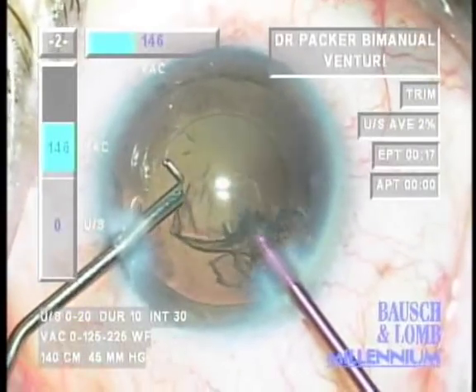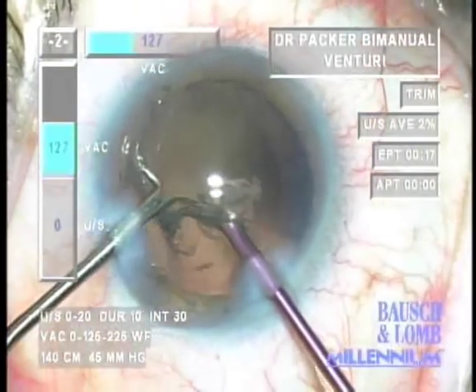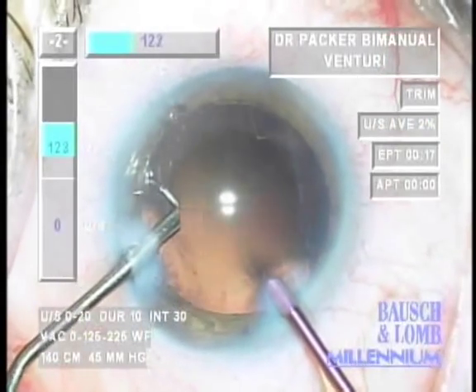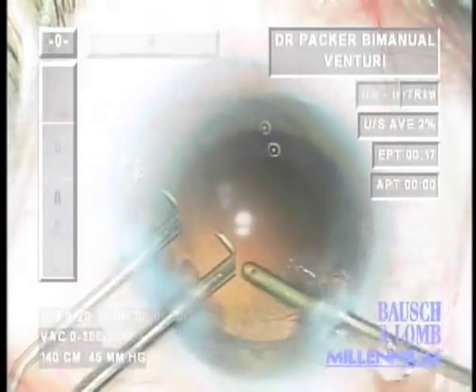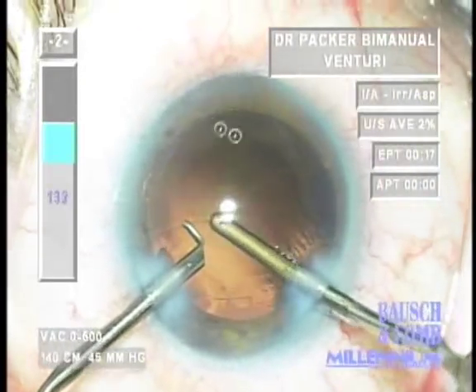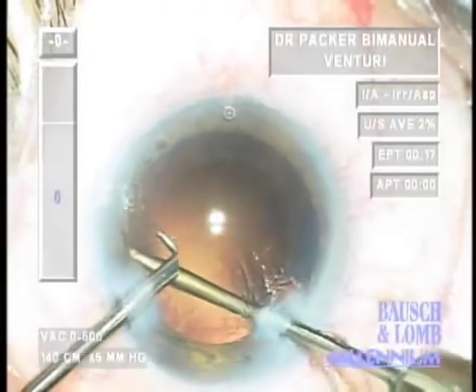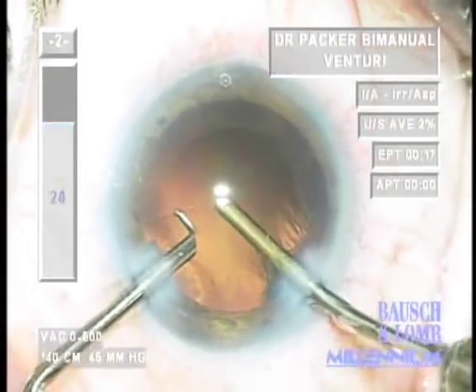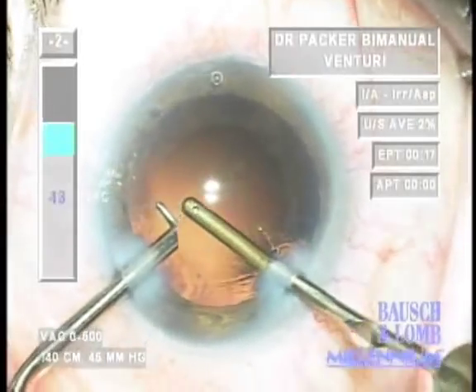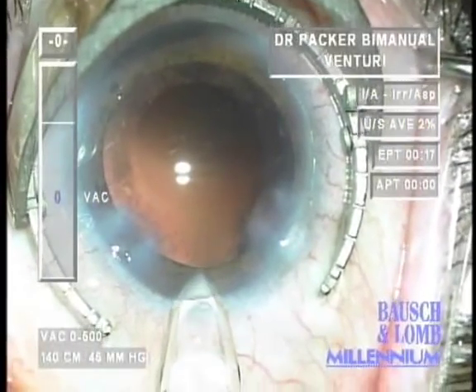A very clean bag is important for prevention of posterior capsular opacification and for the efficacy of accommodative and multifocal intraocular lens technology. Following removal of the epinucleus, just a few tiny strands of cortical material remain, which are removed with the aspiration tip. Total absolute phaco time is still reading zero on the machine, with only 17 seconds elapsed in foot pedal position three.